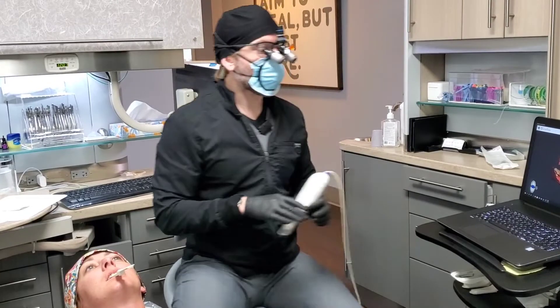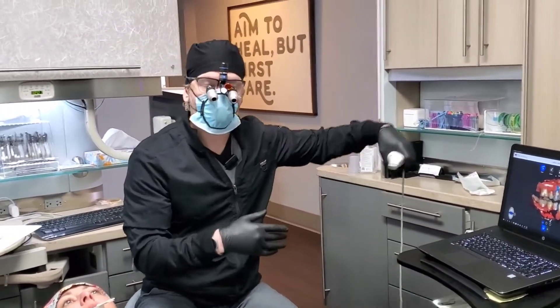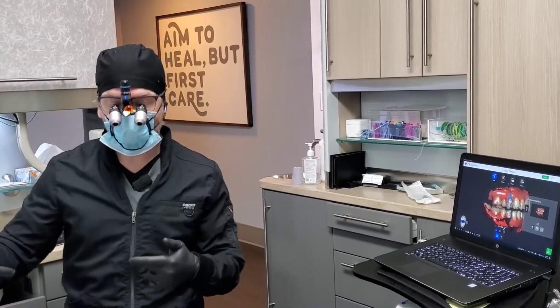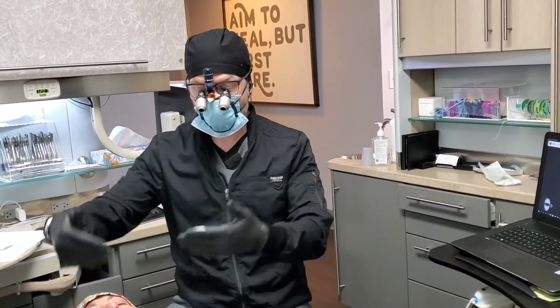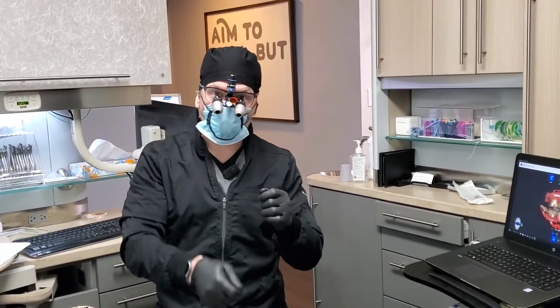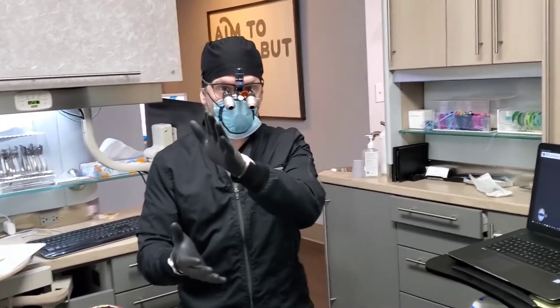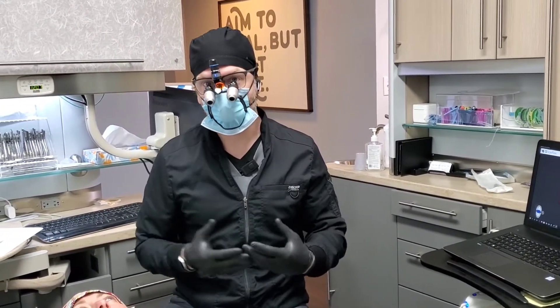And that's it — we're done. How the computer processes it doesn't matter; different scanners are going to behave differently. But one important thing: if your camera really struggles with the dead space between the teeth and can't stitch from the upper to the lower, one thing you can do is take a normal bite registration in this position, take it out, cut it right down the middle, put it back in the mouth, and then scan it. That way you won't have that dead space — you'll be able to scan the upper teeth, bite registration material, and lower teeth. That just cuts out the dead space, the blackness of the back of the mouth.